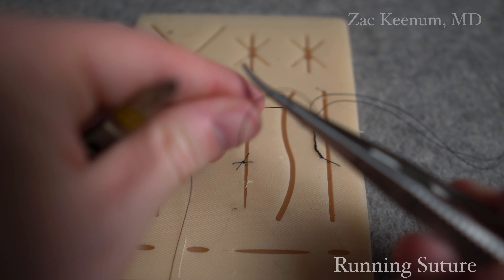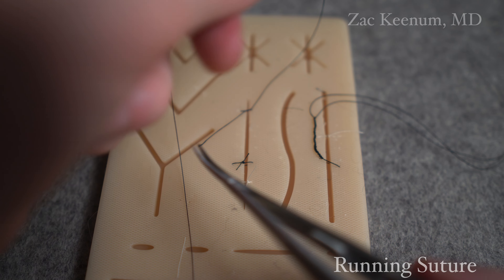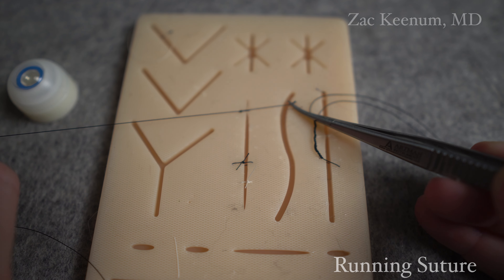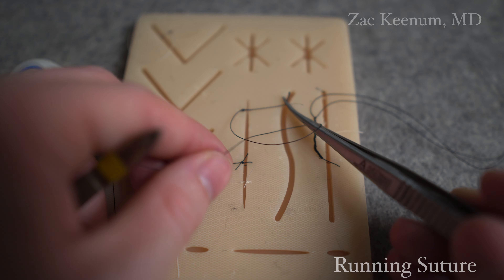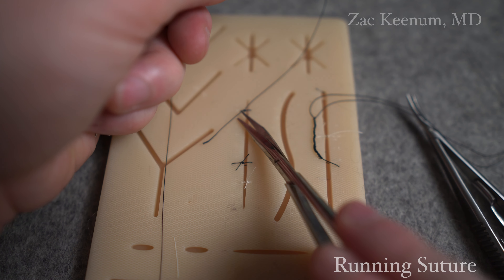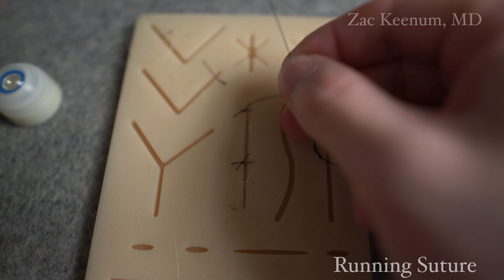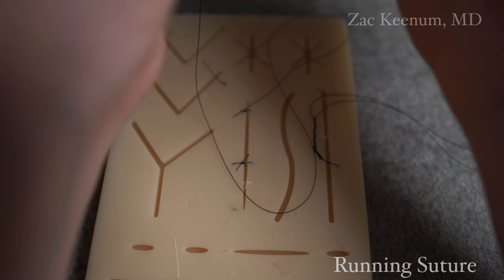Let's do that 2-1-1 here. There's our 2. We come from within the loop - one. And then our last one. We could throw an extra one if we wanted to make it extra secure. But in this case, we're just doing our surgeon's knot, 2-1-1. We're going to trim the tail of just one side this time. And now I'm ready to actually run the suture - we mean a continuous running pass.